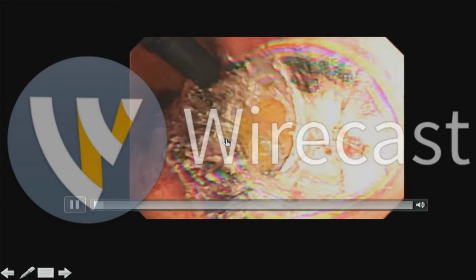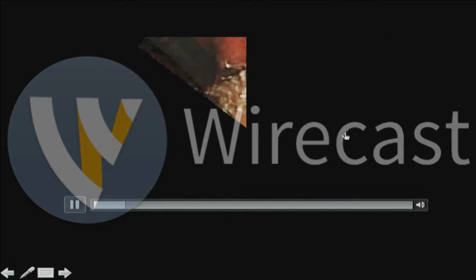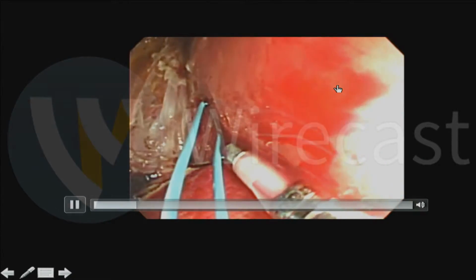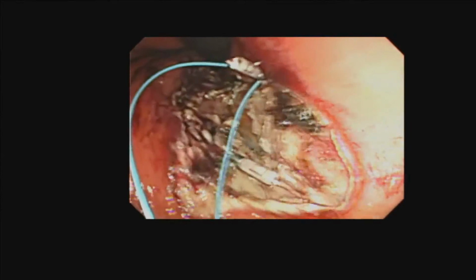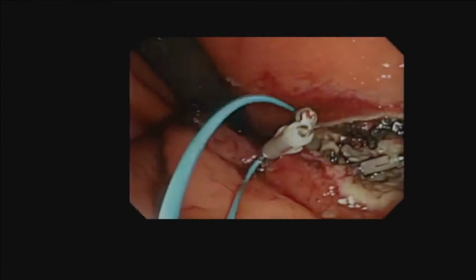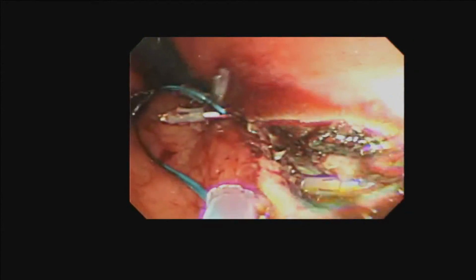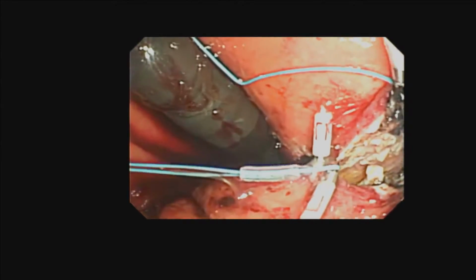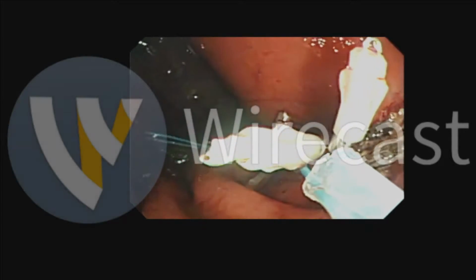And the other thing is, as you can see, a perforated hole like this after resection of a submucosal tumor arising from the proper muscle. This is the endoloop and clip technique. I catch up the gastric mucosa and endoloop, one side of the endoloop with a clip, and the other side catch up and pull back the endoloop.